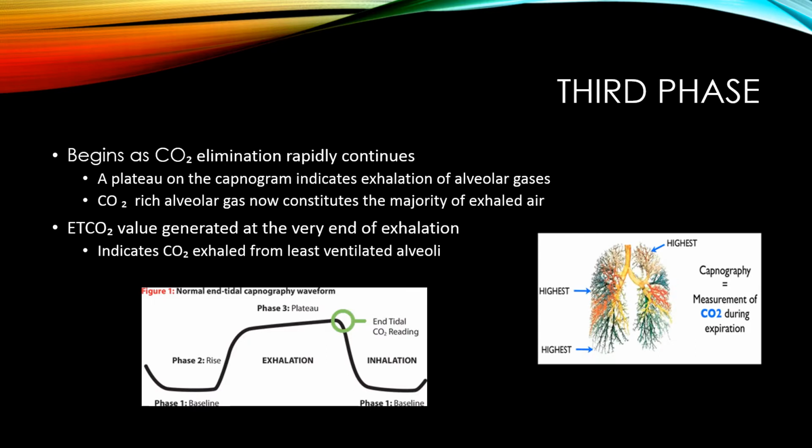When you look at the waveform picture that we have here, you see phase 3 is the plateau, so that is the end of your exhalation phase. And when you finally get the very last bit of the CO2 gases out of your lungs during exhalation, that is going to be your end tidal CO2 reading.